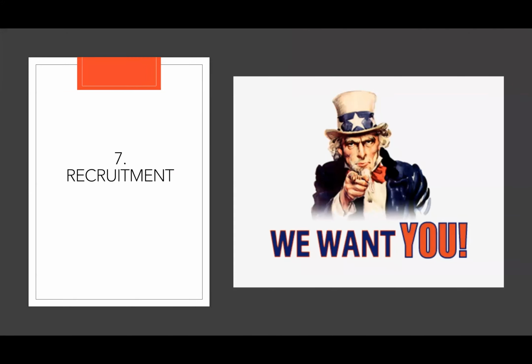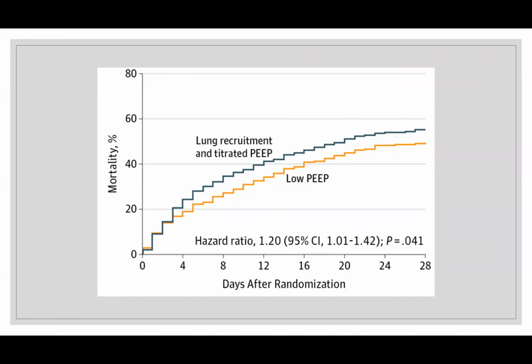What about recruitment? We talk about recruitment not infrequently. This is a trial, the ARDS trial I mentioned from 2017. And they looked at two groups. This is survival or mortality. They looked at a low PEEP group, which was just ARDSnet with the PEEP tables, and then lung recruitment and titrated PEEP. And these folks had regular recruitment.